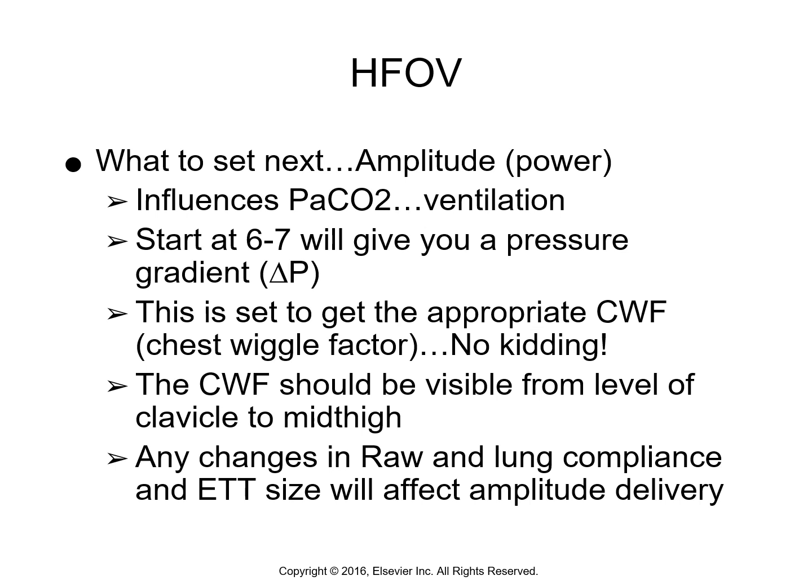This is where you're going to adjust the power amplitude to get that chest wiggle factor. You're looking for it to shimmy or wiggle, kind of rock back and forth from about the level of the clavicle to the mid-thigh on adults.